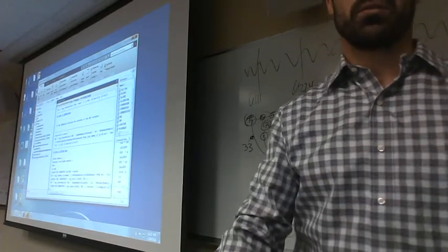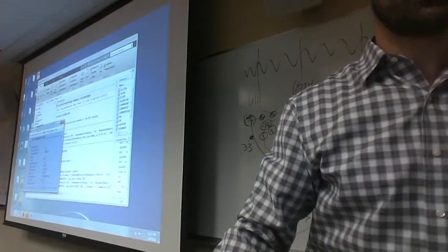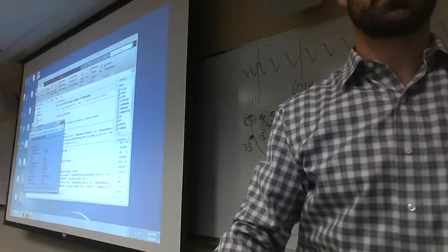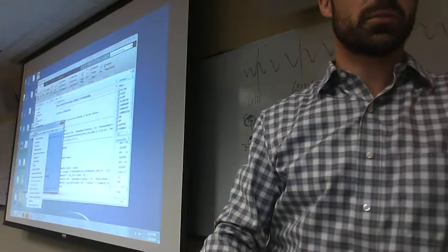Okay. Now what we want to do is slice up the data into epochs. So we can come and do extract bin-based epochs. Actually, what we should do is take a look. Let me just look at something real quick here.